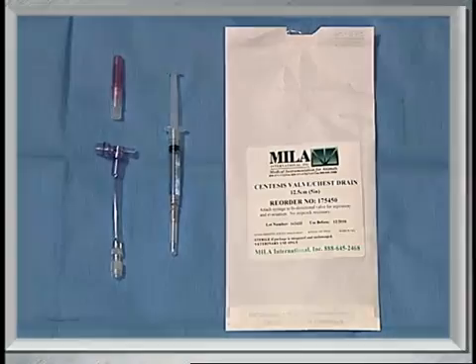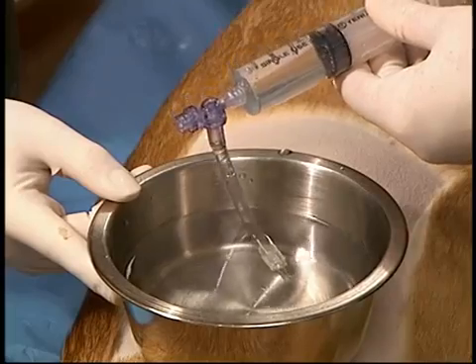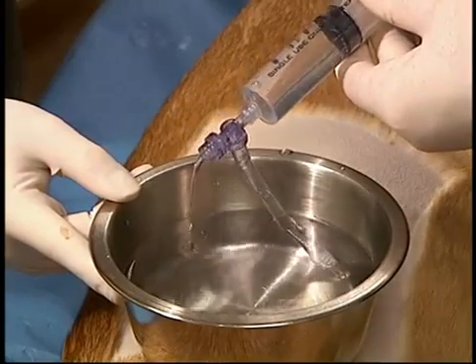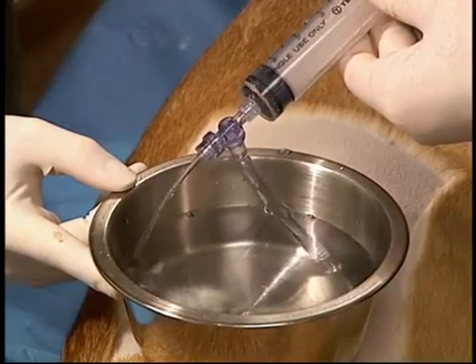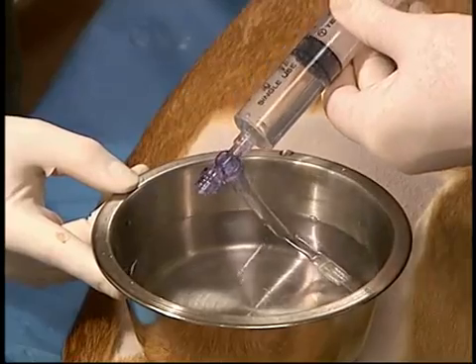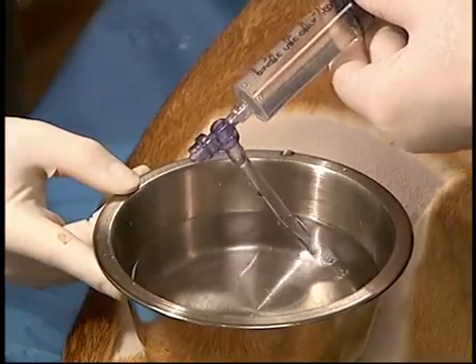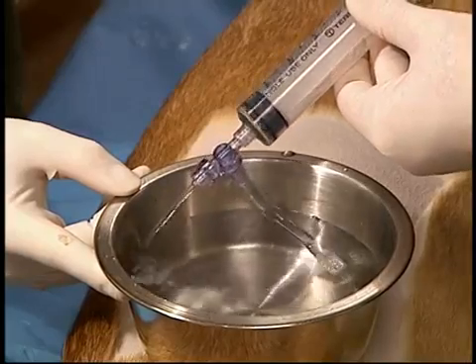The following equipment is required. The Centesis valve chest drain adapter is a very useful device that replaces a three-way stopcock. The adapter is attached to the needle or to a catheter. Fluid or air is aspirated from the pleural space, and then as the plunger of the syringe is ejected, the fluid is ejected out of the other port.